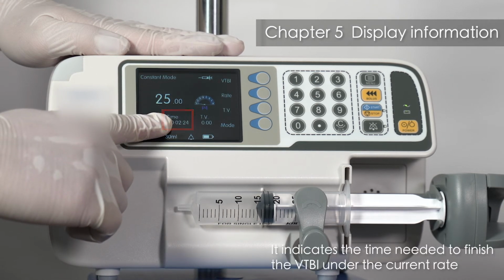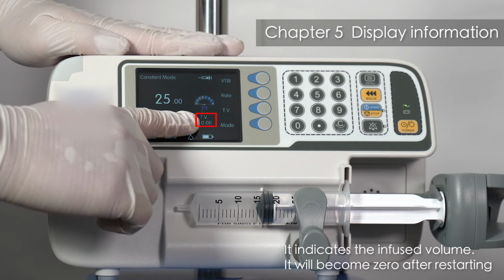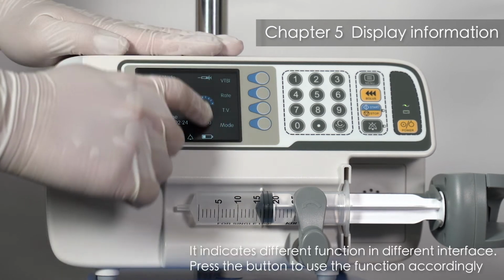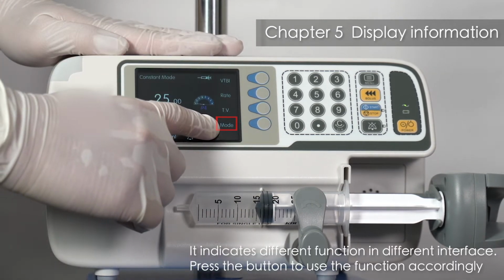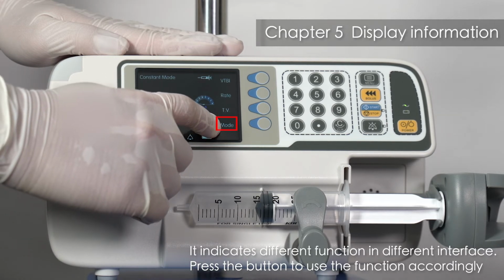Time. It indicates the time needed to finish the VTBI under the current rate. Total volume. It indicates the infused volume. It will become 0 after restarting. Function button. It indicates different function in different interface. Press the button to use the function accordingly.